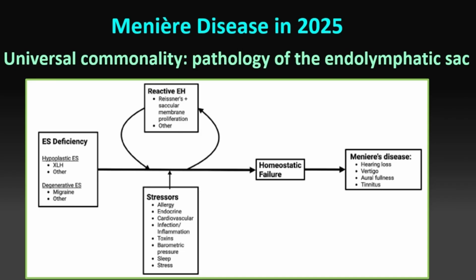Whereas if the vestibular aqueduct is kind of side to side, this person is either just a normal person, or if they have Meniere's disease, then they've got to have a normally developed sac that later on had the lining degenerate. So by looking on CT and looking at the orientation of the vestibular aqueduct, we know if a person has Meniere's disease, which type they have.